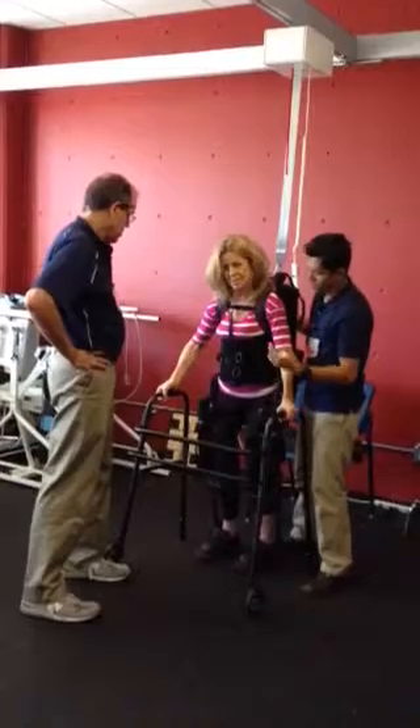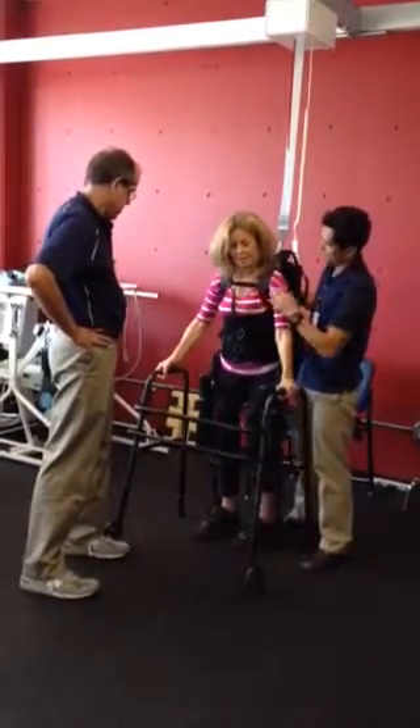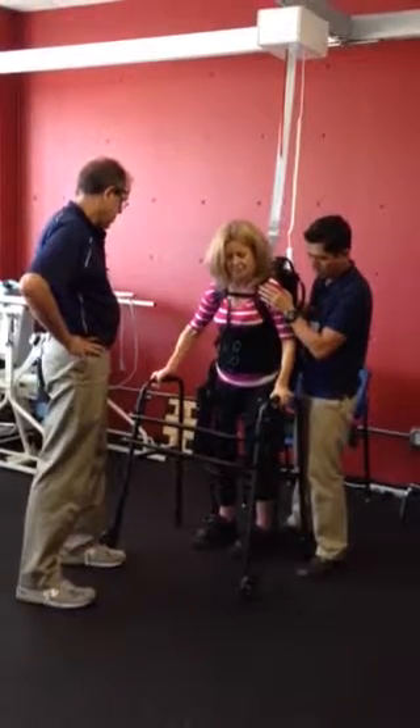Does that make sense? Yeah. Because you need to kind of shift your weight this way so the pressure is off the right leg. Okay, let's go back over here. Left and forward. Good.